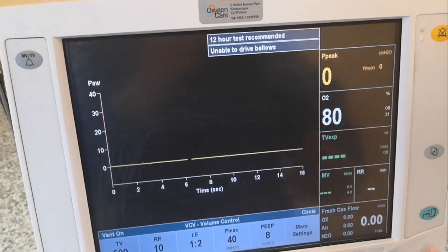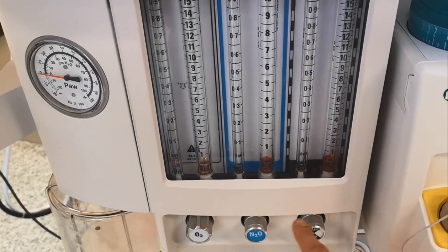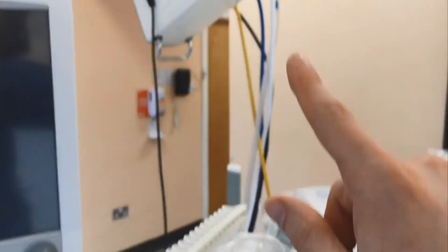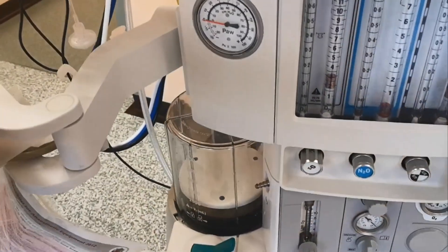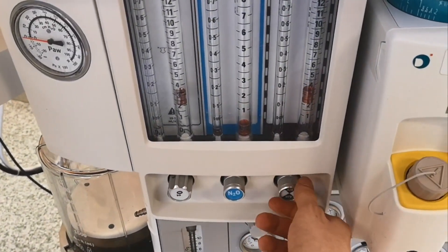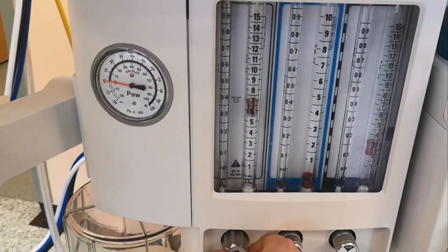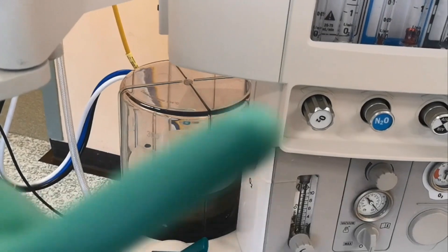The machine is telling me it's unable to drive the bellow because I didn't turn on the gas. The first thing is to open the gas so that air flows from the wall into the machine, passes through the flow meters, and into the circuit. Now that I've opened the flow, you can see the bellow here starts to fill up.